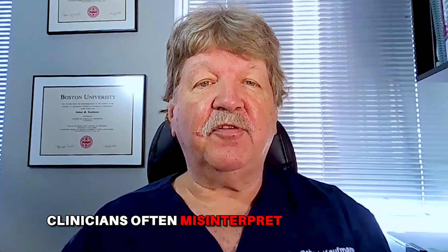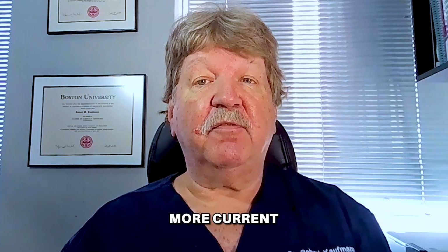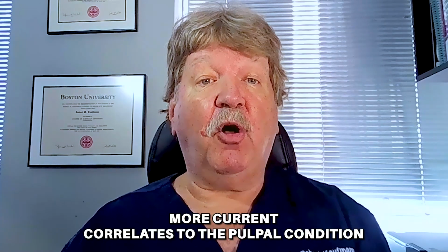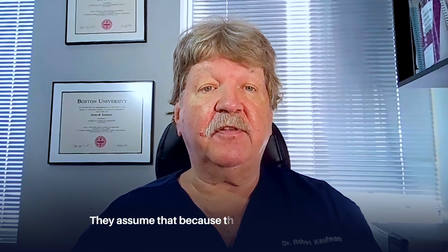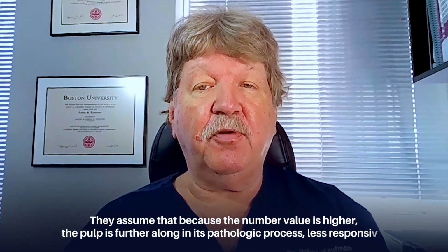Clinicians often misinterpret these numbers to mean that a higher number value, for example, means more current that correlates to a pulpal condition. They assume that because the number value is higher, the pulp is further along in the pathologic process, or it's less responsive. This is a misconception that can lead to errors in diagnosis.